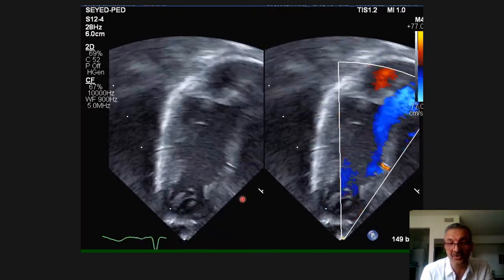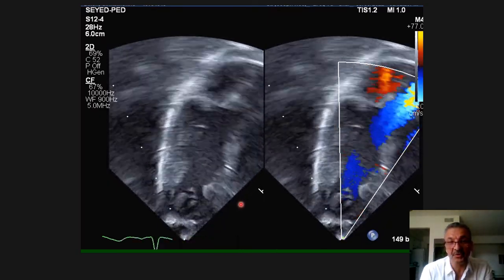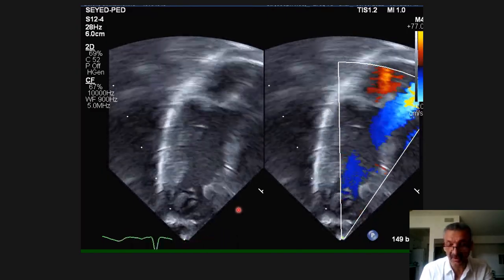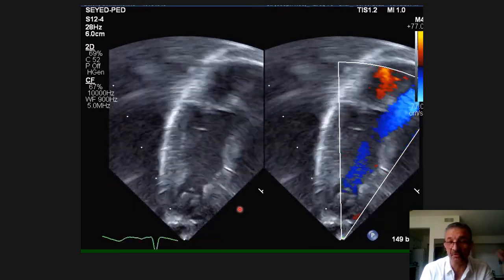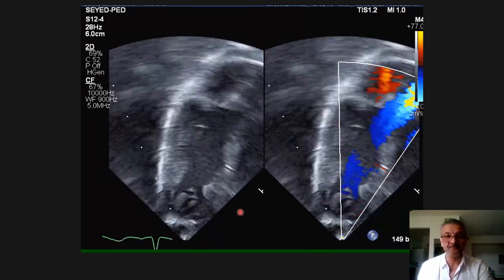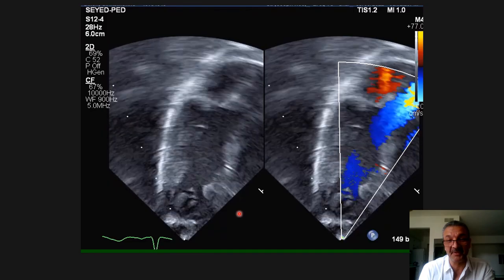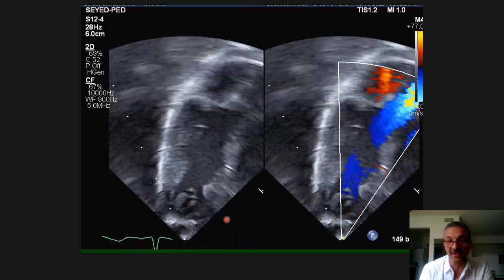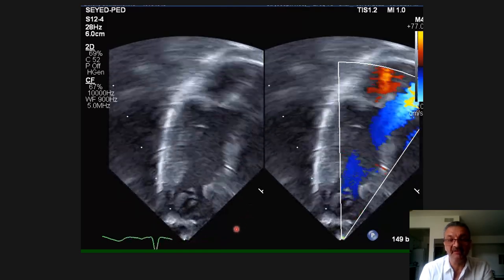This is why for all structural measurements, we try to use axial resolution. For LVOT, aorta, or septal thickness, we use parasternal views because we are using axial resolution. In apical 4, 3, or 5 views, we use lateral resolution, so those measurements will not be completely accurate.